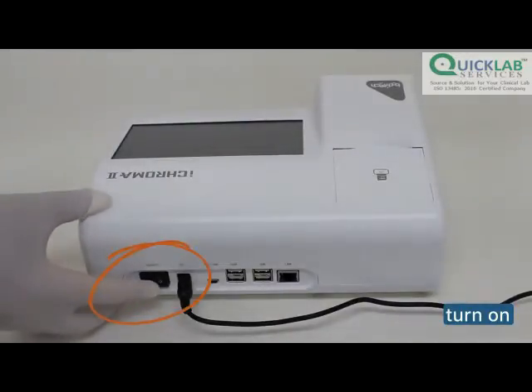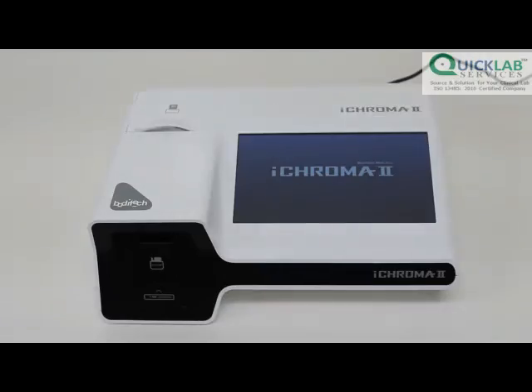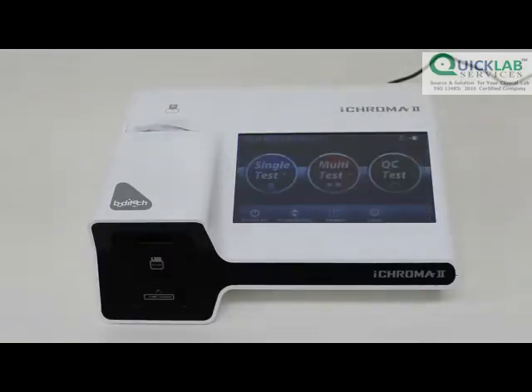Turn on the main power switch located at the rear end of the reader. Wait for the reader to self-check and initialize. You should see the main screen after.